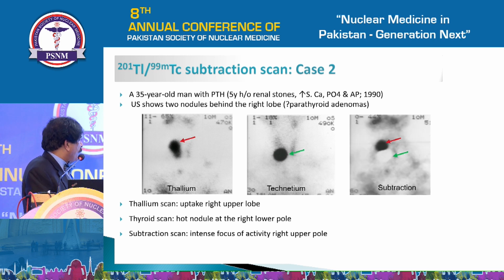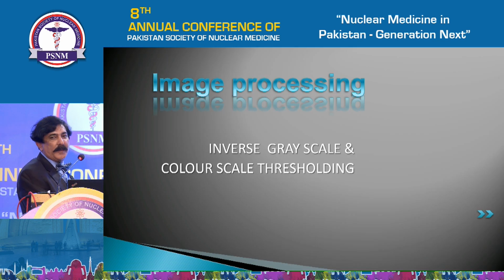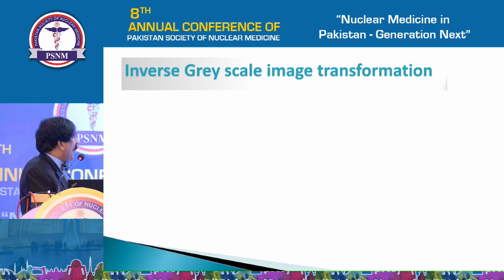So here we have a case of a large thyroid adenoma as well as a parathyroid adenoma diagnosed that far back. So you can see how thallium was very specific to this. I will not go into this.